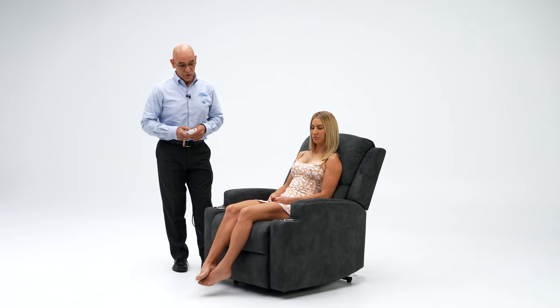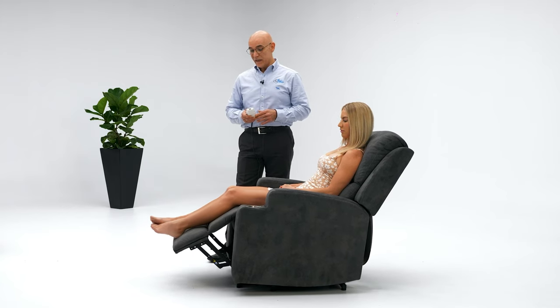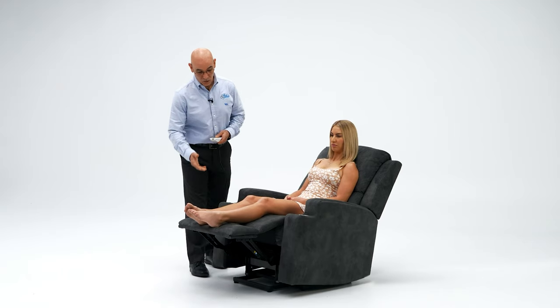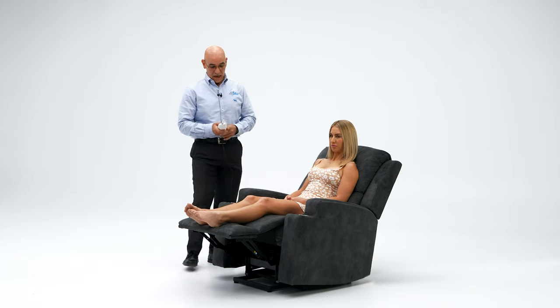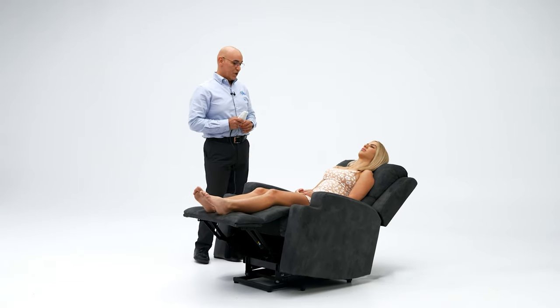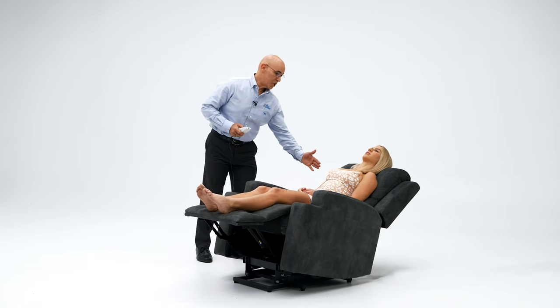With a simple press of a button you can elevate. It's got a very slow and smooth operation, elevating the feet as you can see. It starts supporting the ankles, the calves, the natural bend in the knees, and if we continue it will bring you down to a recline position without losing that lower back support, shoulder and neck.